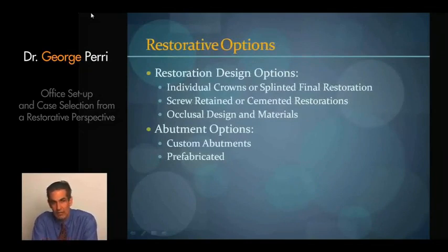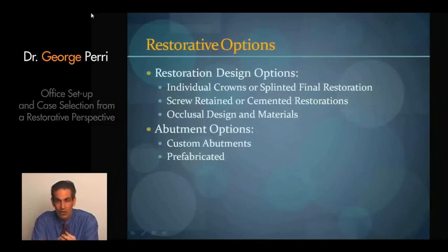My goal today and during most of the lecturing is not to try to teach you every abutment option, but it is to try to give you the skills so that you can understand the different abutments, so that regardless of the name or the newest ones that come out, you can look at it and understand that it's perhaps a custom abutment, it's perhaps a custom abutment that will be cemented in place or screw retained, what's the flexibility, what's the interocclusal clearance, and then you can understand how you can best utilize it.